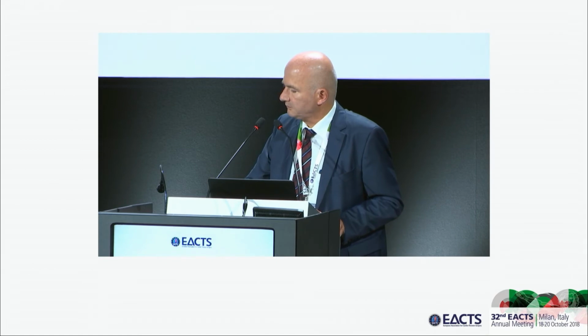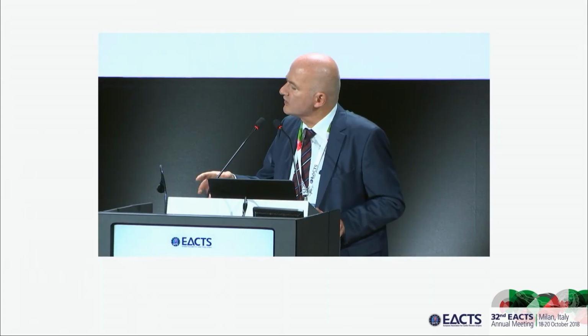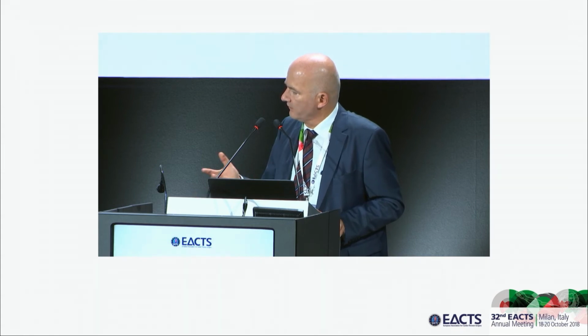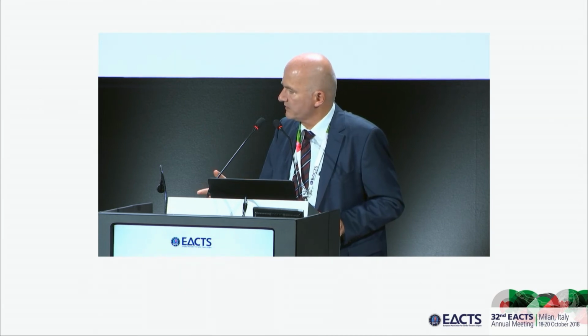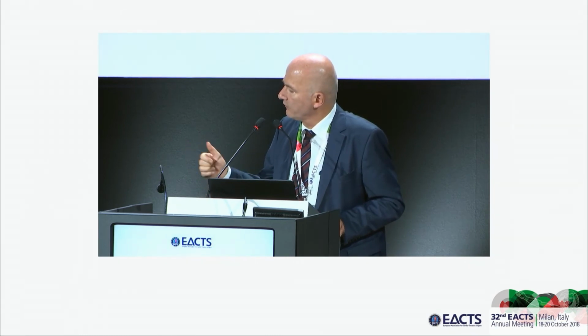When you assess the valve, you are happy with your procedure, and then you do the annuloplasty. Then you reassess the valve after? No, the way I do it, and this is the nice thing about the suture annuloplasty, it doesn't distort the aortic root. So actually, I assess my valve, I assess the need for annuloplasty. Whatever annular diameter is 27 and larger will have as a consequence the annuloplasty, and I try to shrink it down depending on body surface area and geometric height to an average of 23.